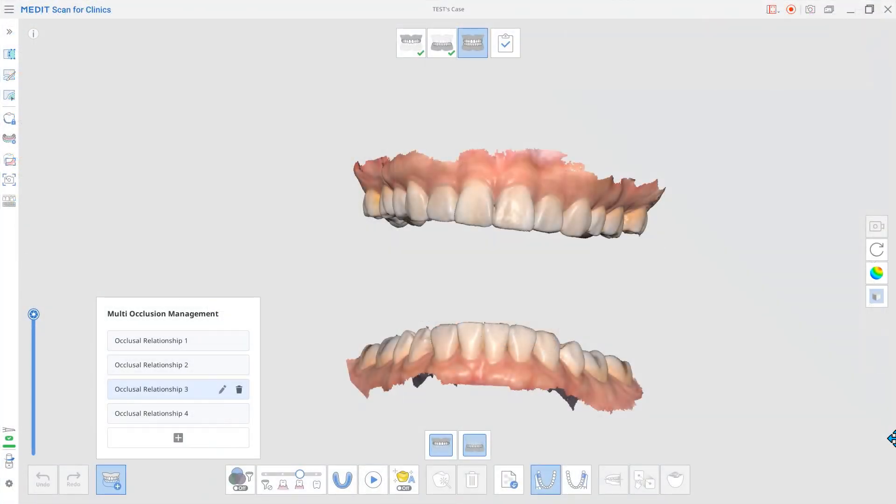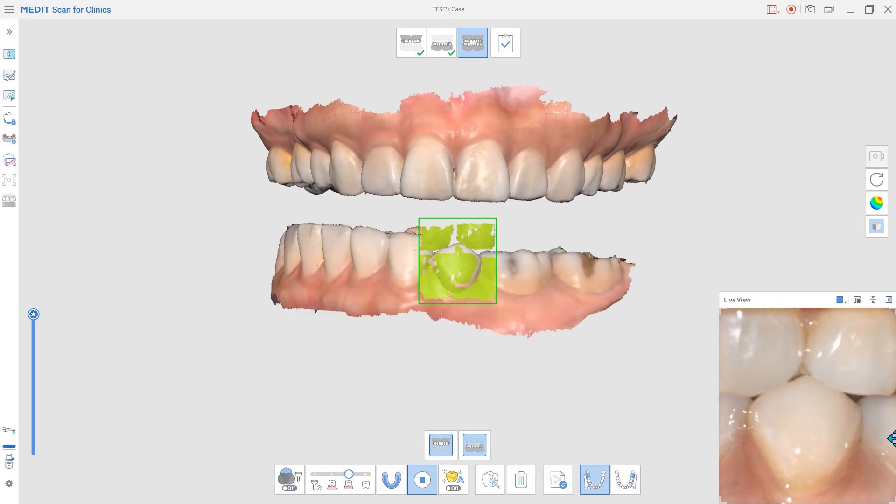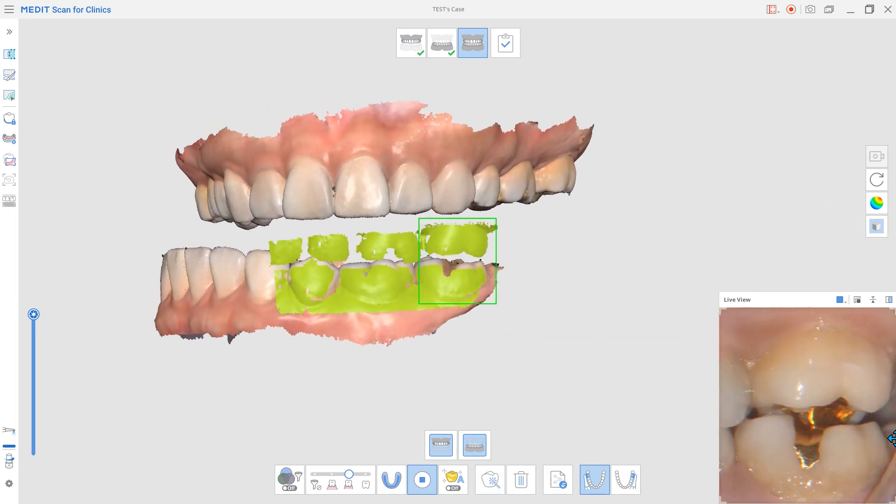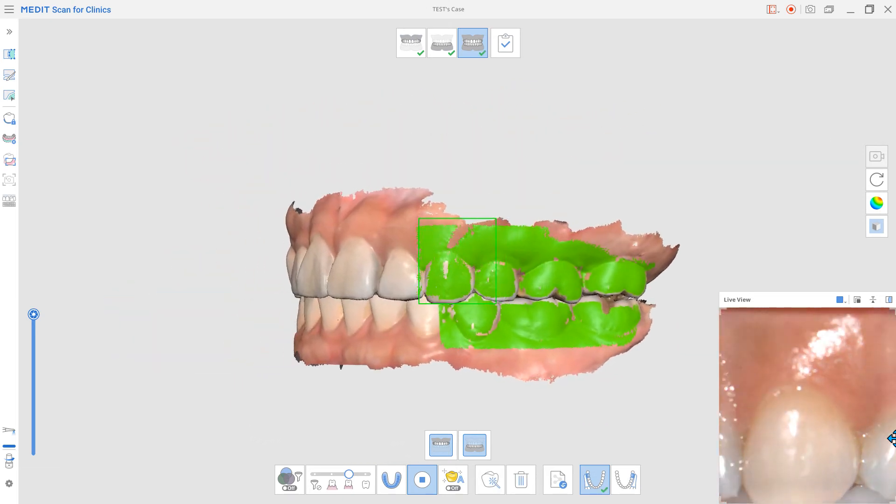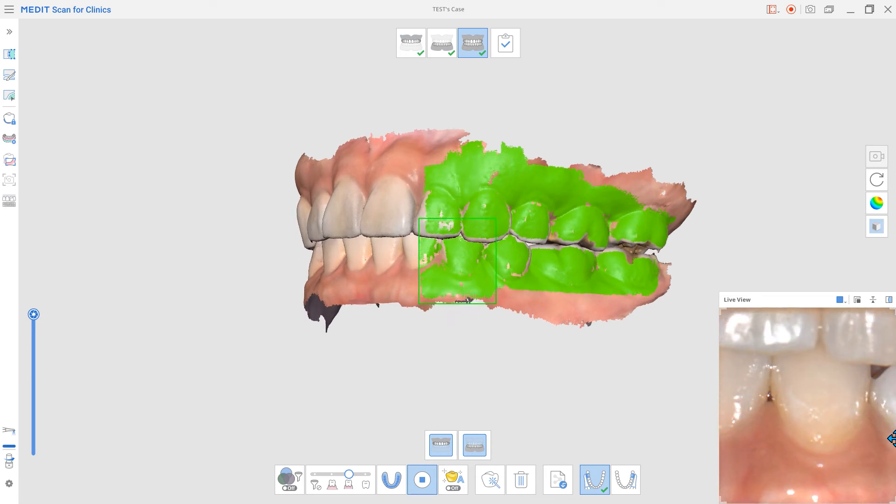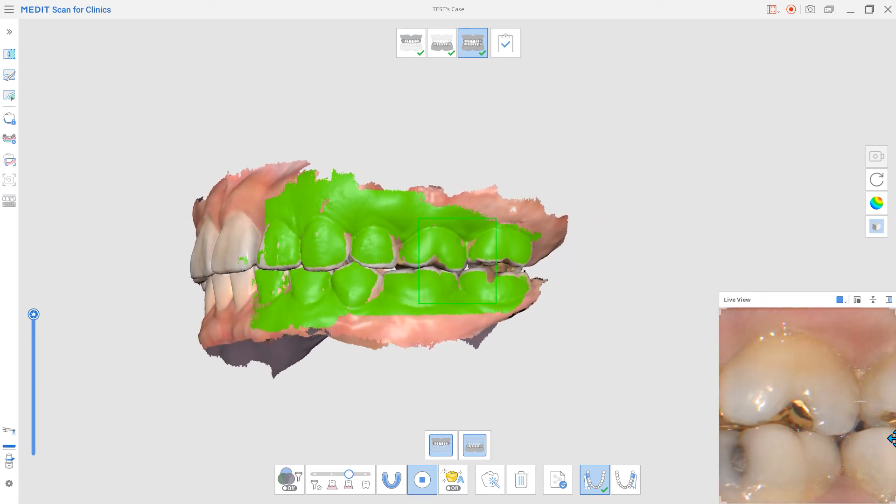And lastly, we have improved the occlusion alignment feature. Now, no matter the scan strategy used to capture the data, you will be able to quickly align the data in the occlusion scan stage.